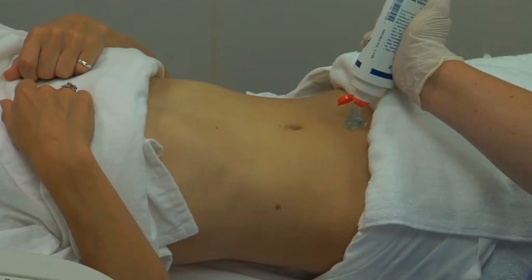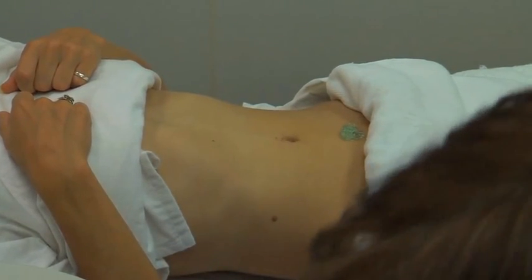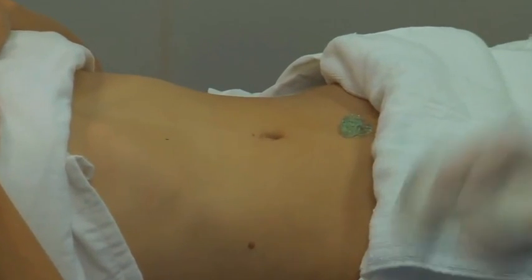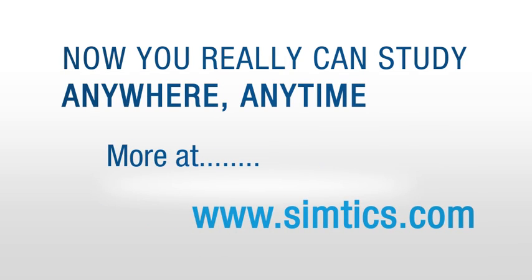To scan the urinary bladder, ask the patient to lie supine on the table. Apply pre-warmed acoustic gel to the lower abdomen along the midline. Place the transducer in the midline, just superior to the symphysis pubis in the longitudinal.